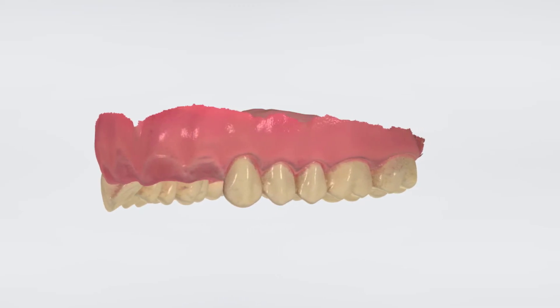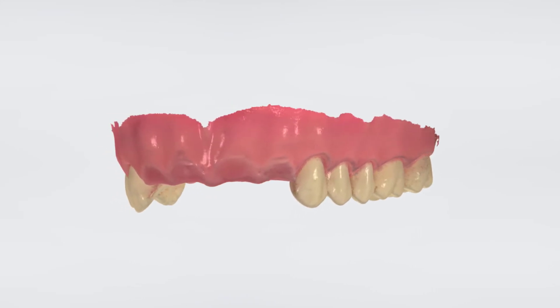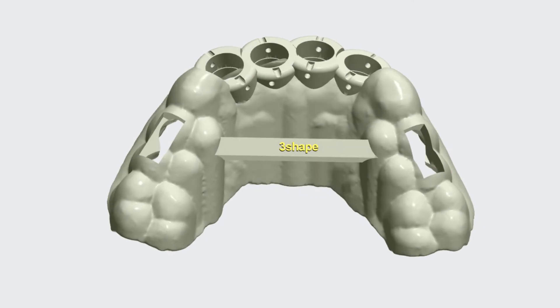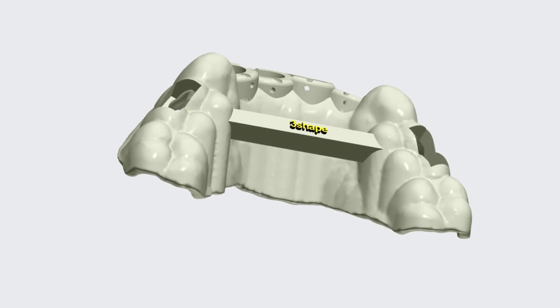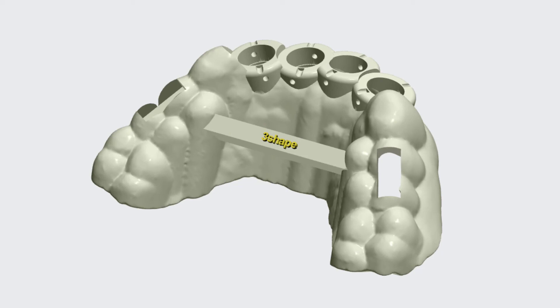Initially, the guide will be placed on the teeth, but as this guide covers a four-teeth gap, we can also use the soft tissue for support. Remember the possibility to position a bar going from one side of the jaw to the other to further increase the stability and also use it as a handle. You have now learned how to scan a patient missing front teeth.